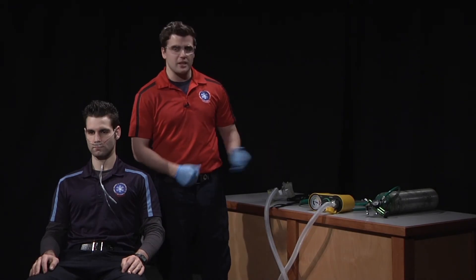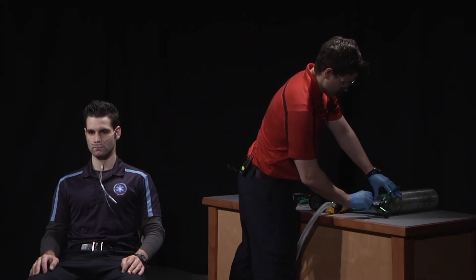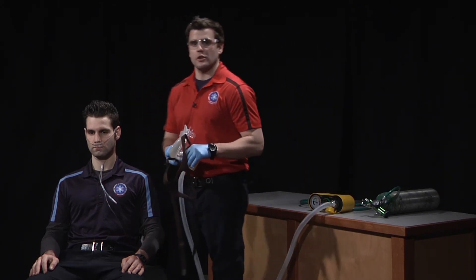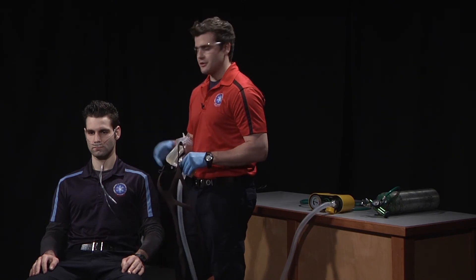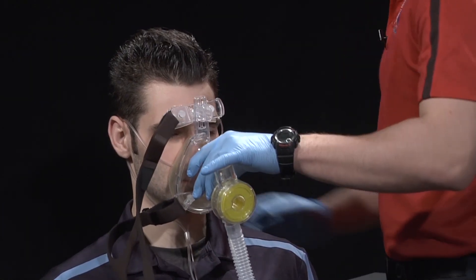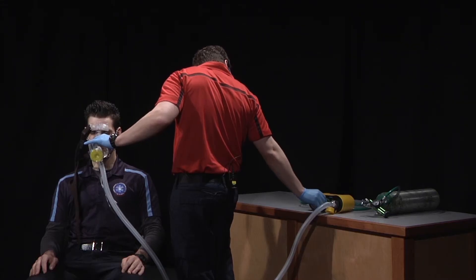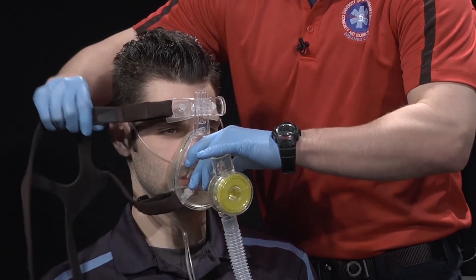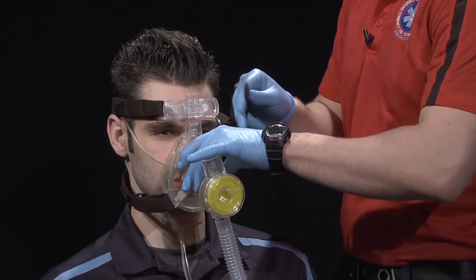After our CPAP machine has been assembled, we're going to go ahead and turn our oxygen on. From there, we're going to take our CPAP mask and place it over the nose and mouth of the patient while making sure the end-tidal CO2 nasal cannula stays in place. We're then going to titrate our machine to the desired setting, and then coach the patient to breathe normally and to adjust to the air pressure while securing the mask.